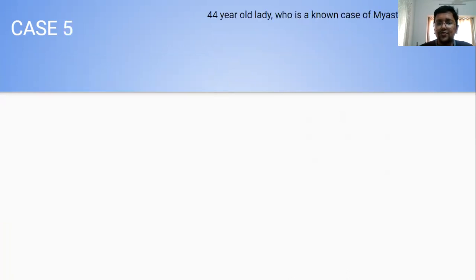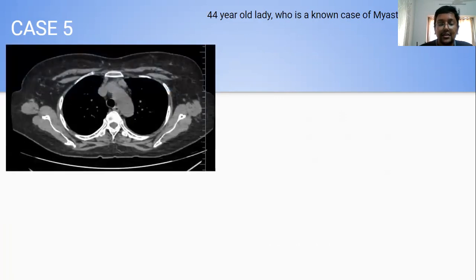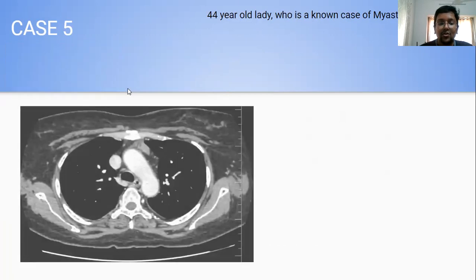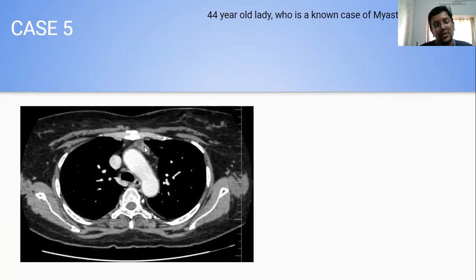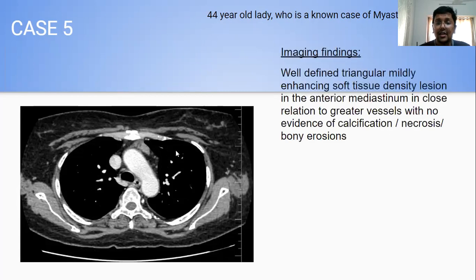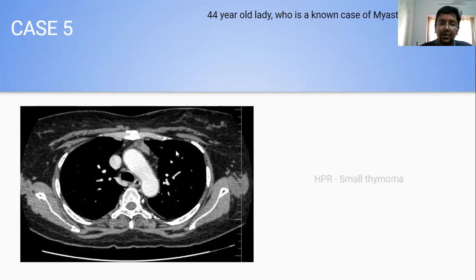My fifth case was a 44-year-old lady who was a known case of myasthenia gravis — which, as we know, has great correlation with thymoma. Plain CT revealed a well-defined, mildly lobulated soft tissue density lesion involving the anterior mediastinum, small in size and mostly towards the left side. Near-homogeneous enhancement was noted on post-contrast images, with no evidence of infiltration of adjacent vasculature and no bony erosions. This turned out to be a small thymoma.